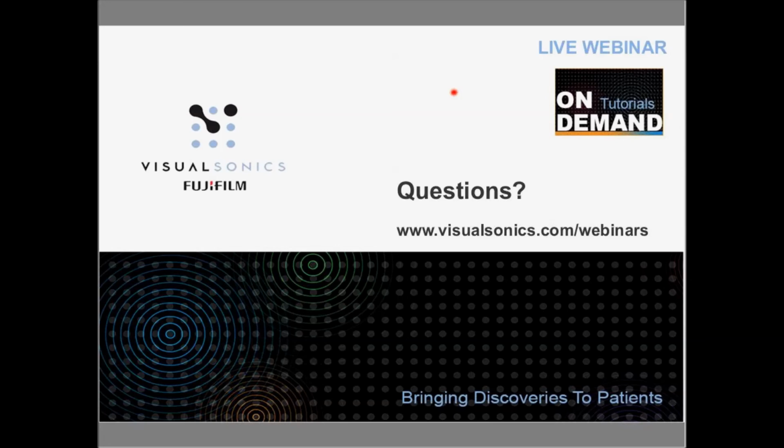Stephen, function can be measured in M mode, LV trace, and now VevoStrain. In your experience working with customers and their publications, which package is most reliable? I would say that it's a design of experiment question.